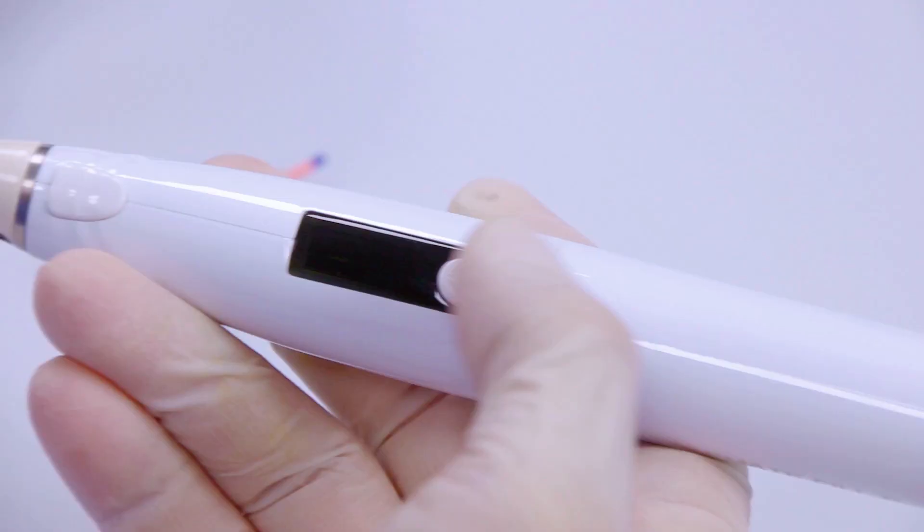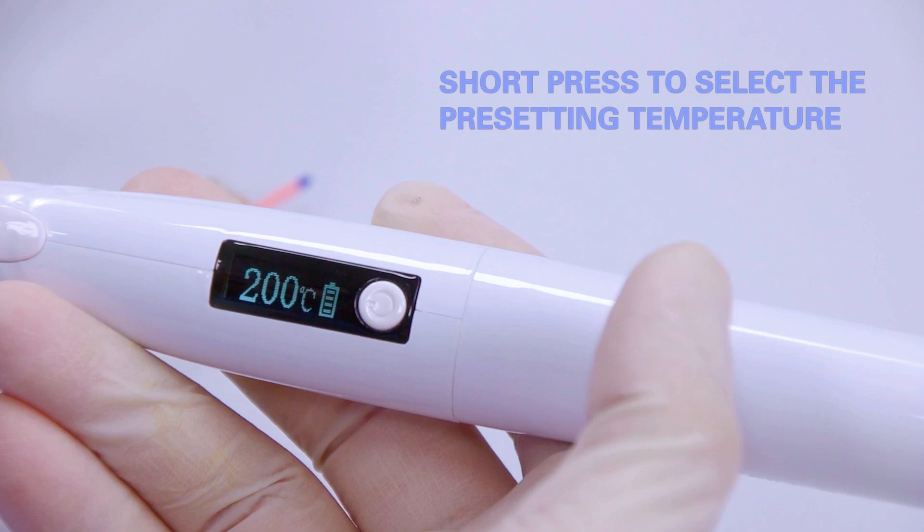Install the heater. Long press to switch on, short press to select the pre-setting temperature.